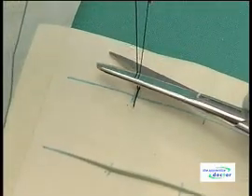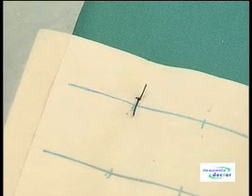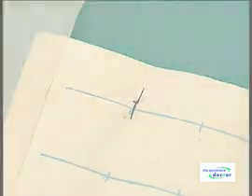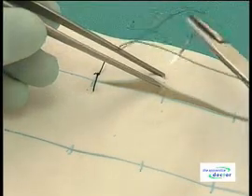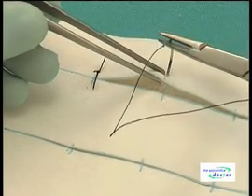Leave a long enough piece of suture material beyond the knots to facilitate easy removal of the sutures at a later stage. Alternatively, the interrupted suture can be placed as follows.